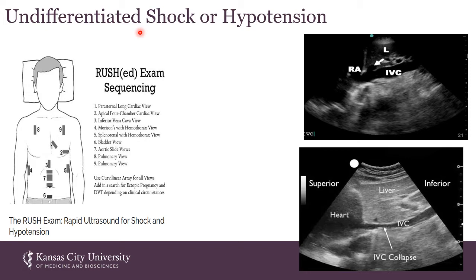And it also could be some sort of drug overdose. And so very quickly I can get an idea on a patient that can't give me any history that is in shock. And so with that said, come on over here.